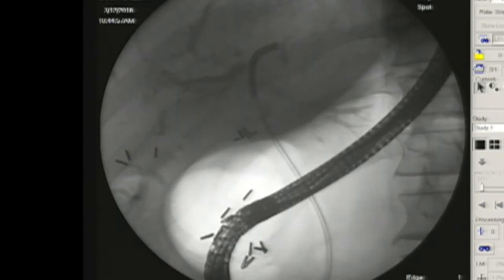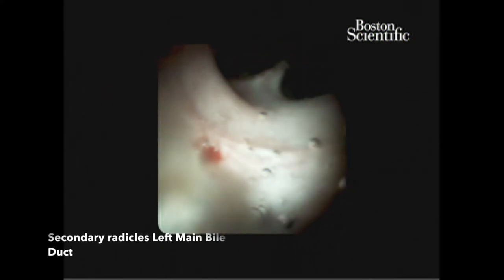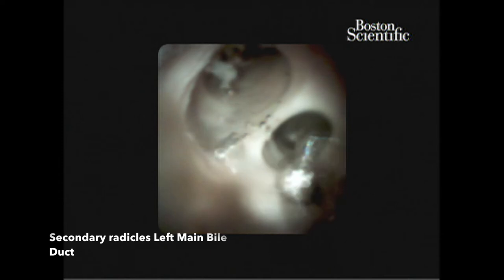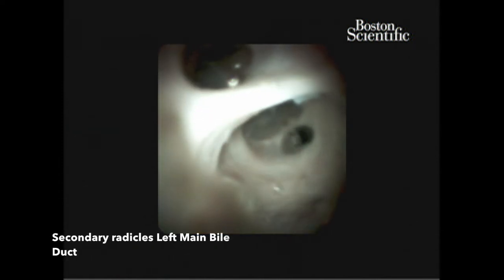Here you can see the tremendous flexibility of the SpyGlass high-definition cholangioscope. With SpyGlass DS 2.0, we're able to better visualize the biliary mucosa. Similar to the artist's rendering, here you can see the secondary radicals of the left main bile duct, and it's clear that there's no involvement of tumor at this level. Without involvement of tumor at the secondary radicals of the left main bile duct, we're able to confidently say this patient has a resectable cholangiocarcinoma.